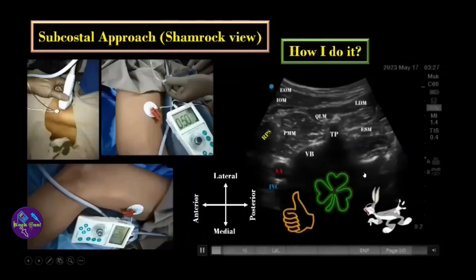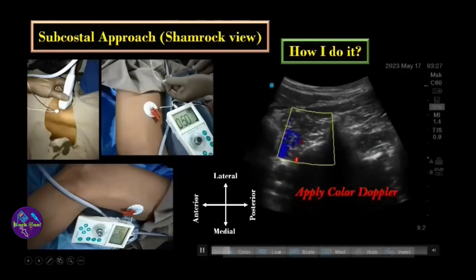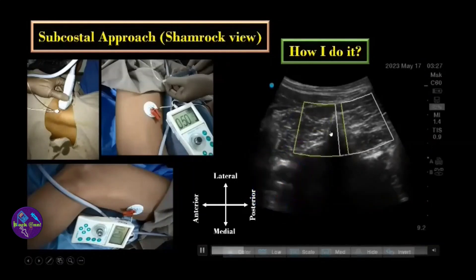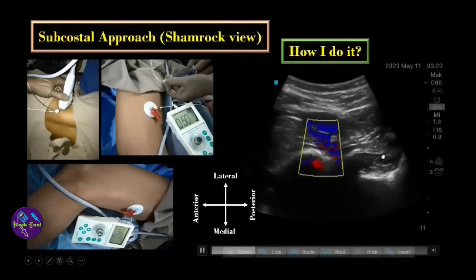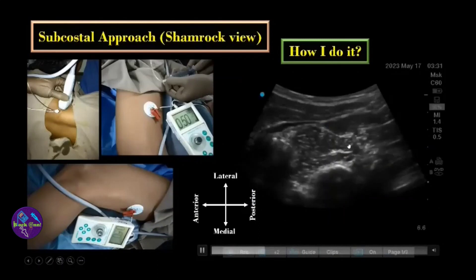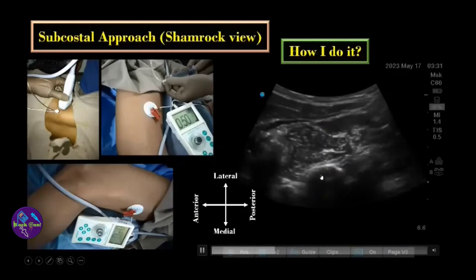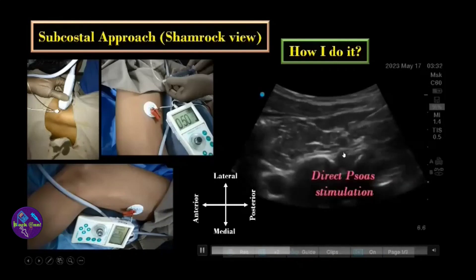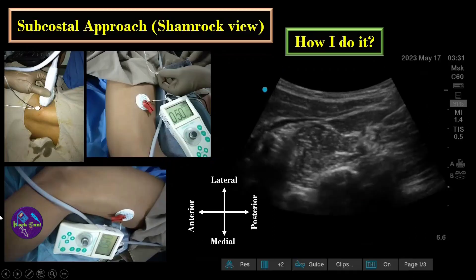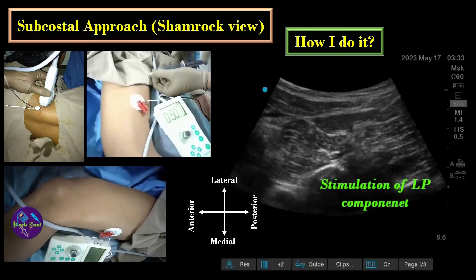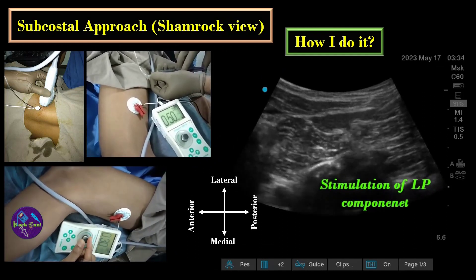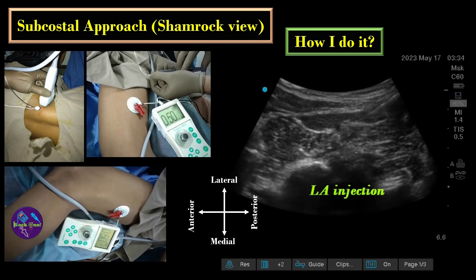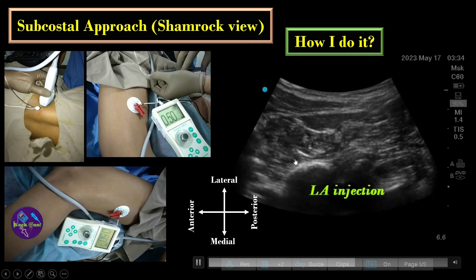First identify the pattern, then always use color Doppler to identify blood vessels in the psoas major muscle and along the needle trajectory area. Once you confirm no blood vessel is in the path, insert the needle from the appropriate direction to reach the lumbar plexus element — in this case one direction was avoided due to a small pulsatile blood vessel. Once the needle touches the lumbar plexus element, stimulation is obtained, and at 0.4 to 0.6 milliamperes you can start injecting the local anesthetic. Remember, neurostimulation here is used for identification, not localization.